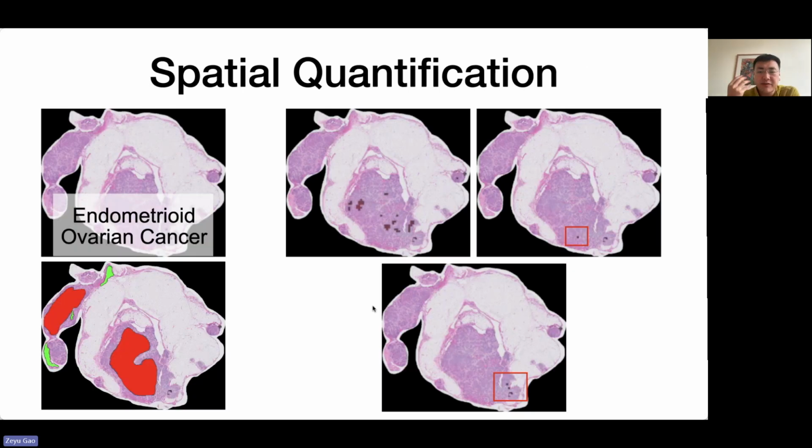And we analyzed the quantification results of each model. Some of them actually focus on only very few regions, as we can see from here, and they made the decision based on only several patches. So it cannot be used for spatial quantification, and even our clinical pathologists can't believe this result because you really focus on a very tiny part of the slide.